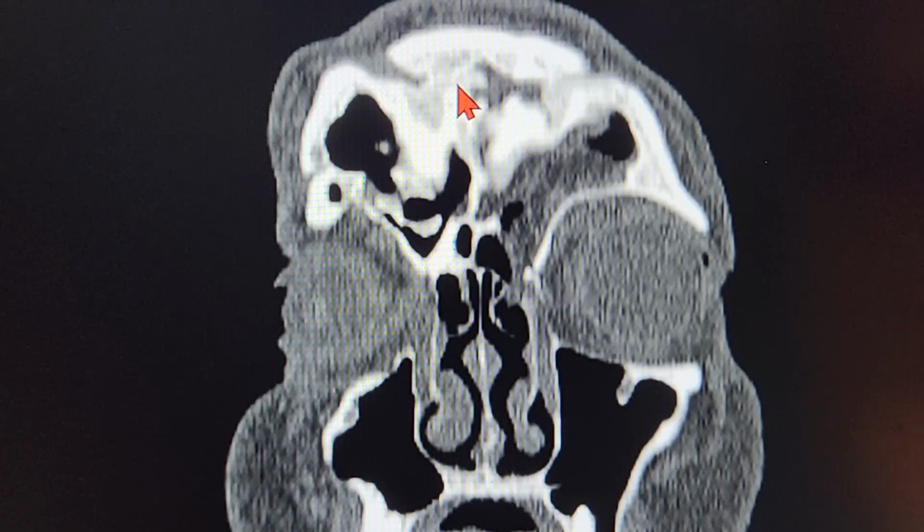When the bone heals, it heals in an abnormal way if a major surgery was performed earlier. So the bone heals irregularly, maybe osteotic, maybe infected bone. And you can see there's a lot of abnormal bone growth within the sinus, as you can see right now. So probably this is the downward projection. You can see that's the left frontal recess here.